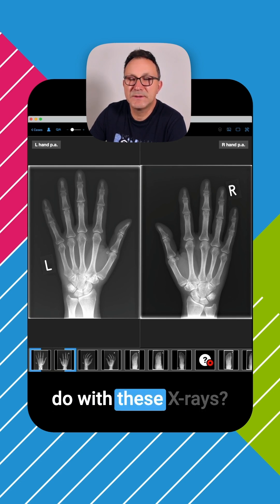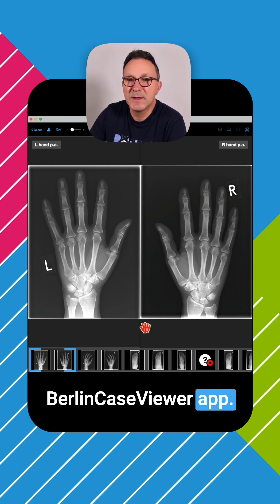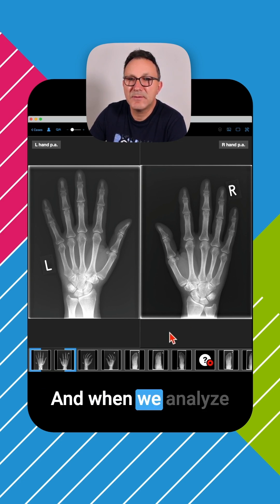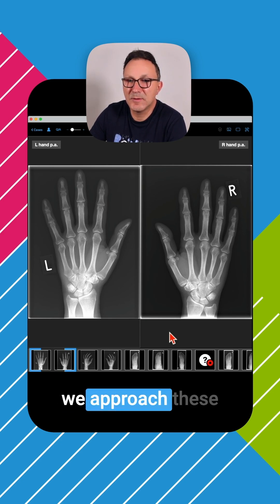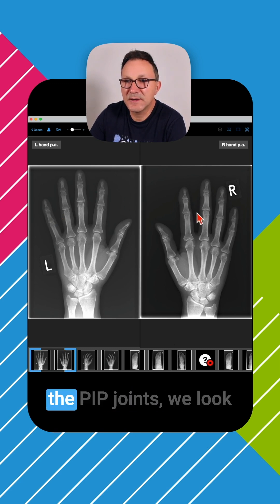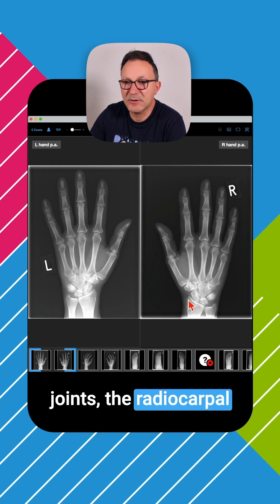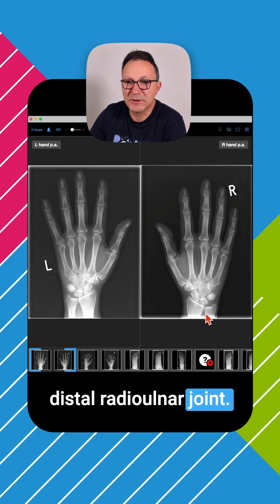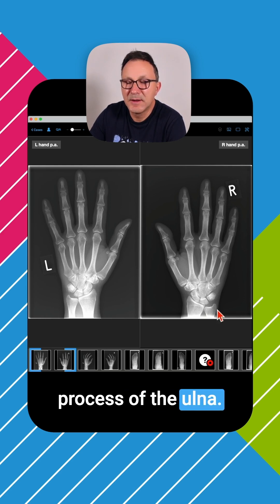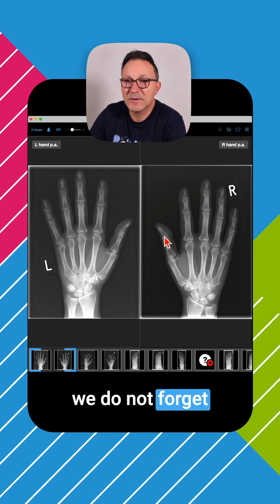So now what can we do with these X-rays? I already aligned both of these X-rays side by side here in the Berlin Case Viewer app. It's important that you always try to do a side-by-side comparison, and we approach this joint by joint group — first the DIP joints, then the PIP joints, the MCP joints, the CMC joints, the intercarpal joints, the distal radiocarpal joint, and the distal radio-ulnar joint. We take special care to analyze the styloid process of the ulna, and we look especially at the MCP joints as those are affected most frequently, not forgetting the thumb.